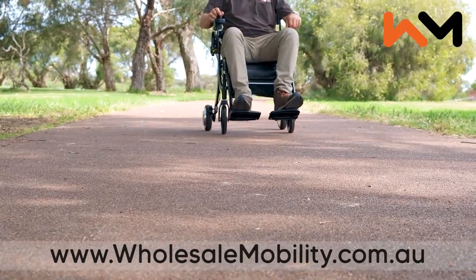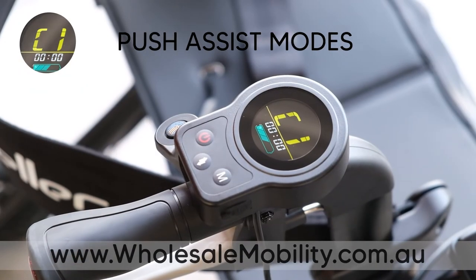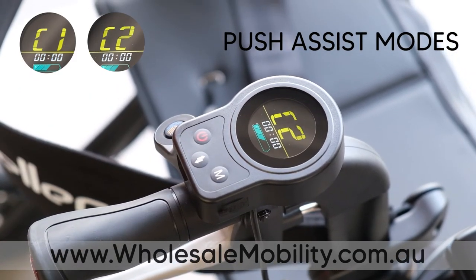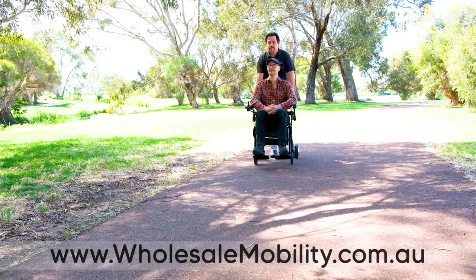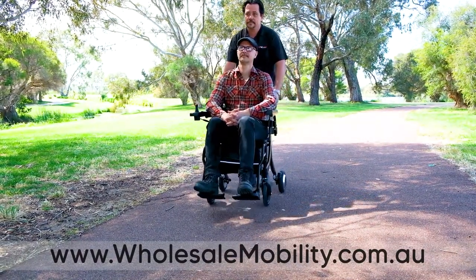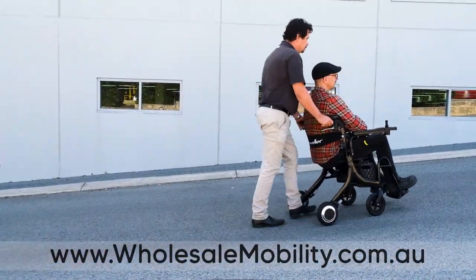The Evo is fitted with two controllers. At the back near the handles, you will find the attendant controller or push assist controller. You can easily choose between different modes. The push assist mode engages the motor as you start moving, making it easier to push when traveling up hills.